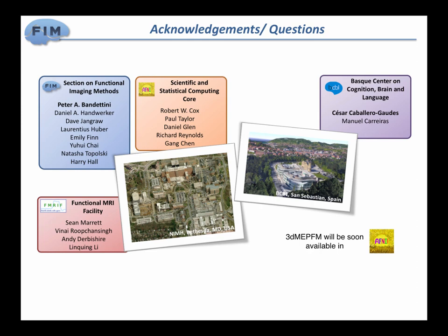So initially, I wouldn't change the defaults. If it doesn't converge, I would run it a few times because it's non-deterministic. You might run it once and it doesn't converge, and then you run it twice and it does. So I tend to run it 5 or 6 times. Then, if it hasn't converged, is when I would start playing with those.